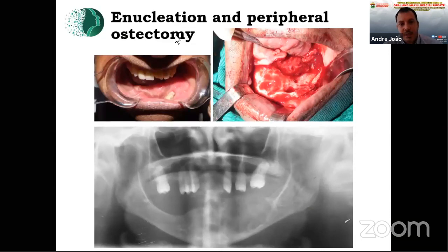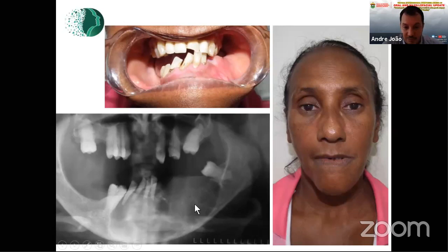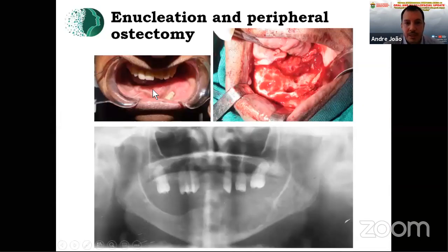So what I did here, you can see this is marsupialization. The patient during marsupialization, I did the same. The lesion here looked like at least a multicystic one. You can see a lot of different cavities here, probably. So I explored this lesion, did the marsupialization, removed the tooth, and here's the lesion after a few months of marsupialization. At this time, I did that treatment.